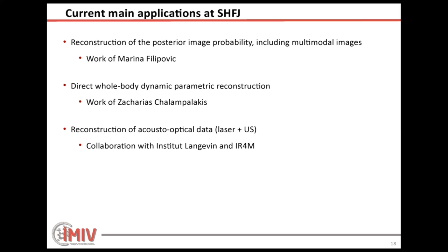But we want to stick with this for the moment, with a very, very general command line argument. So when you want to use any type of projector, you just say, for example, option minus proj, then you choose your projector, and you give the list of options that goes with this projector. We want to have it flexible, so that maybe later we can provide an interface that will generate a command line. But we are all using command lines in the collaboration, and it's not a problem for us. So that was not a priority at the beginning. For the moment, it's just this.